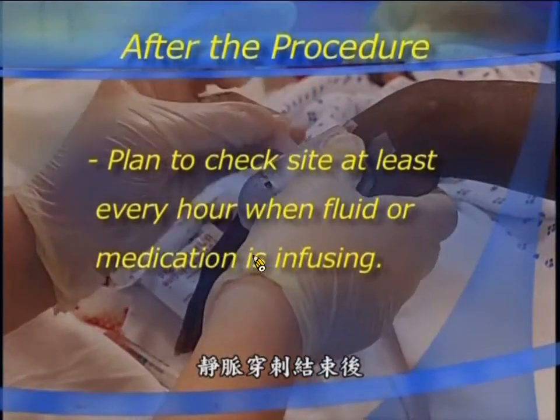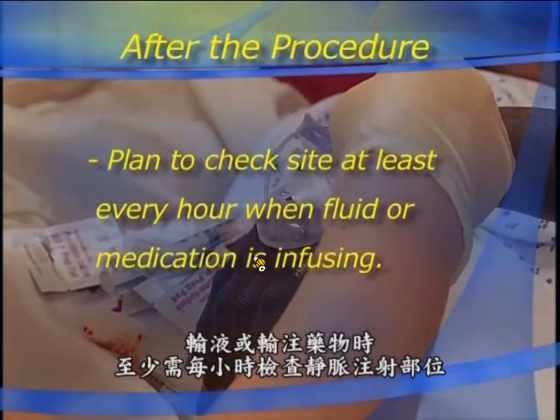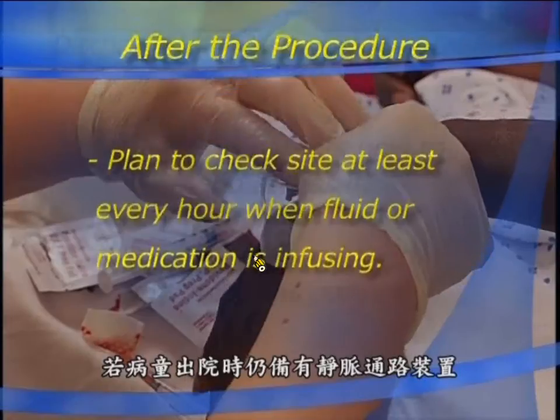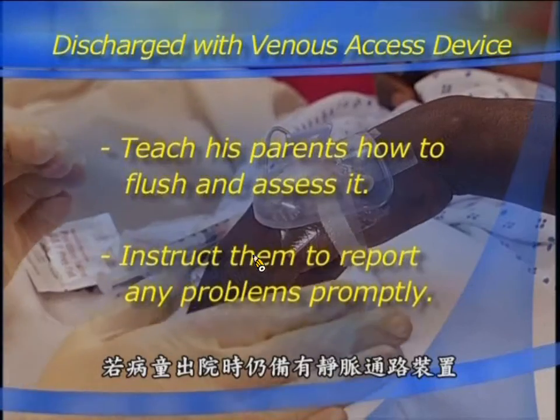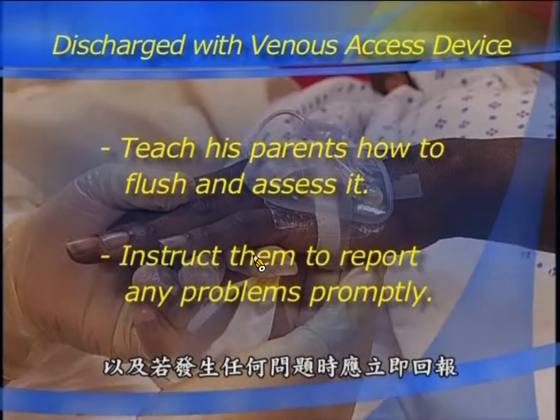After the procedure, plan to check the site at least every hour when fluid or medication is infusing. If the child is discharged with a venous access device, teach his parents how to flush and assess it, and instruct them to report any problems promptly.